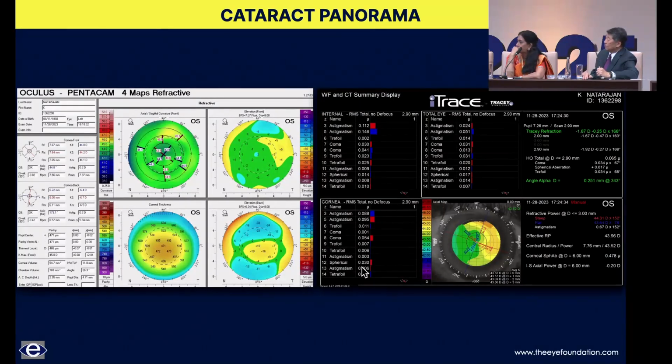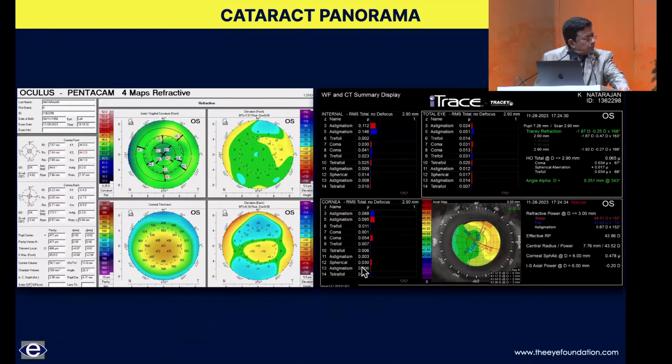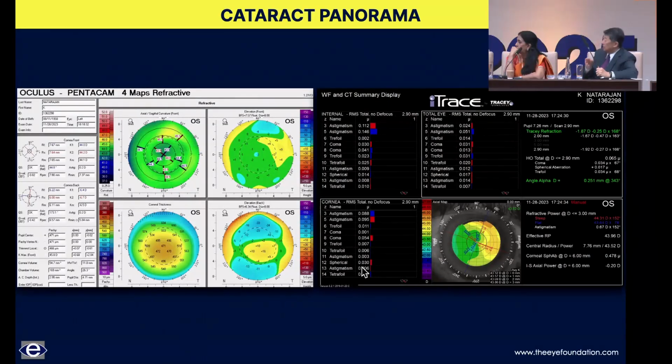What are your indications for using LAL lenses? Well, when we started the LALs, the obvious ones would be LASIK, RK. The ones that weren't as obvious were maybe mild keratoconus, a lot of things where maybe something is a little tricky. But the one that I didn't expect, which is really popular: we have a lot of patients who say, I want to read without glasses.